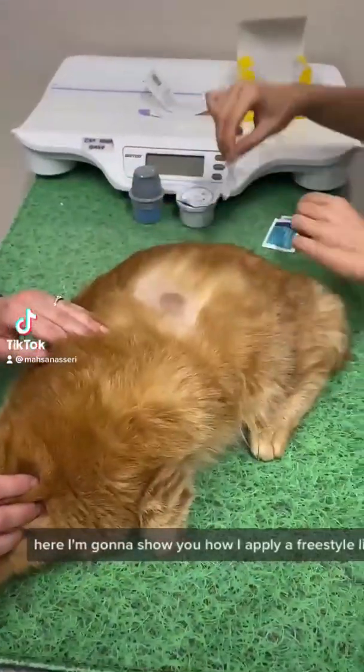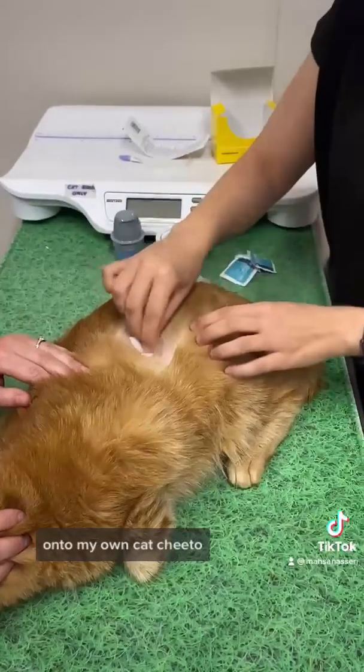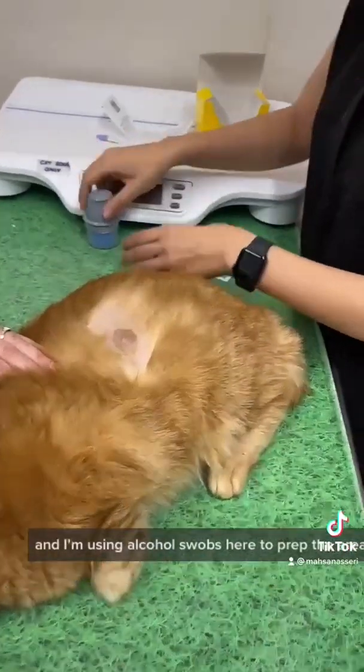Here I'm going to show you how I apply a Freestyle Libre for continuous glucose monitoring onto my own cat, Cheeto. Off camera, I've already clipped the area of fur that I will be using, and I'm using alcohol swabs here to prep the area.